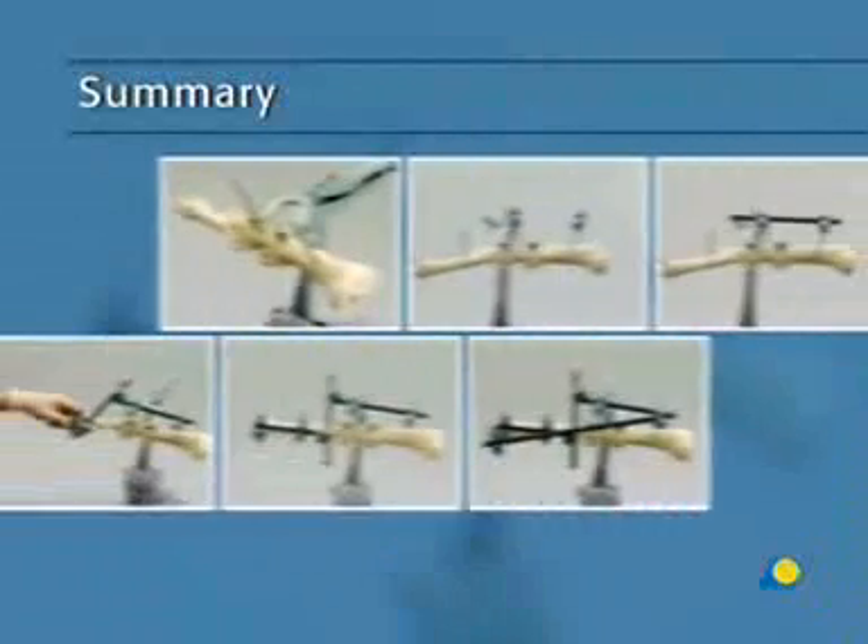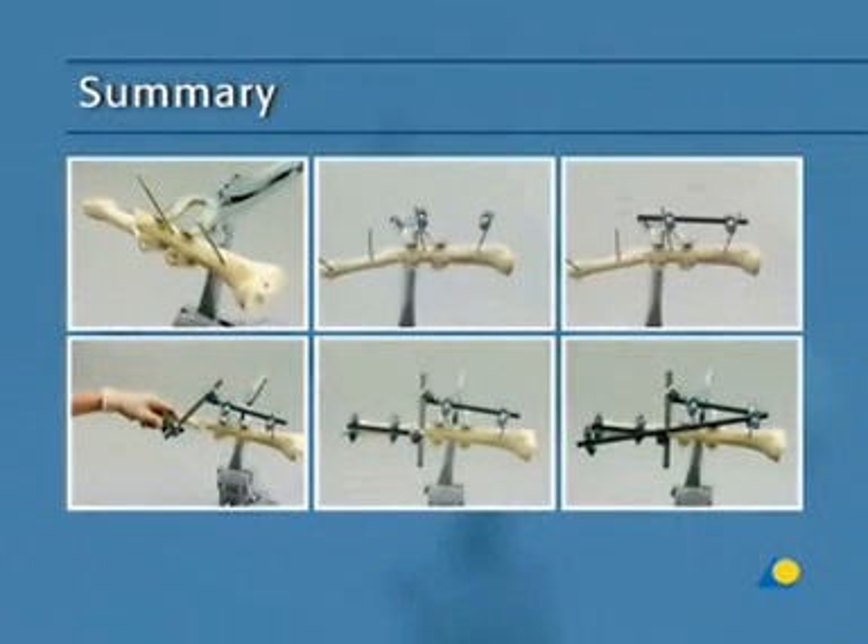This presentation has demonstrated the choice of frame type, the positioning and correct insertion of the Schanz screws, and the construction of the rod-to-rod modular frame.